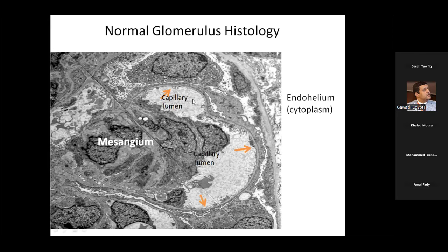It's why they are one compartment, because both are facing the bloodstream, with no boundaries between the mesangium and the bloodstream. It is just the fenestrated endothelium. Also, there is no basement membrane to hide the mesangial area from the bloodstream.